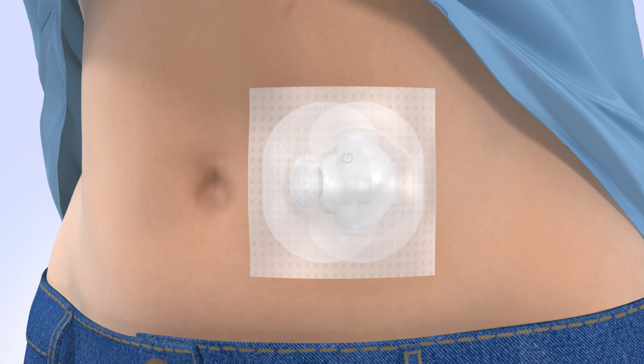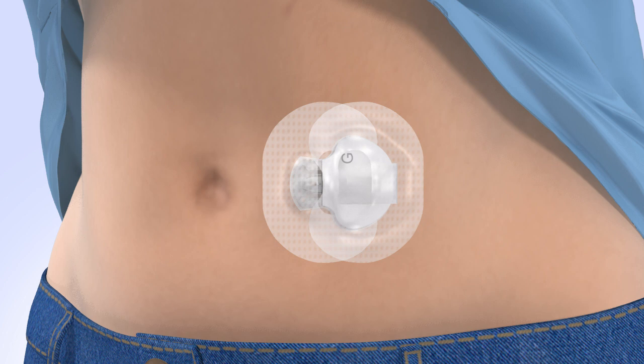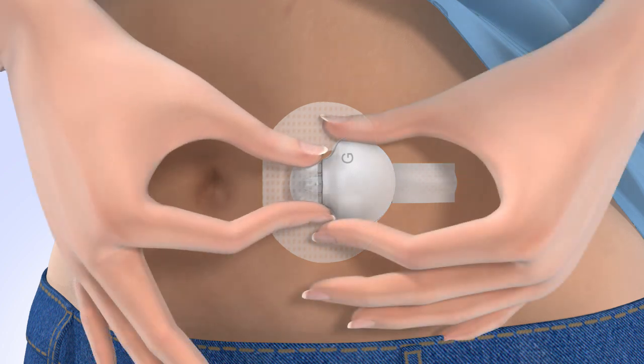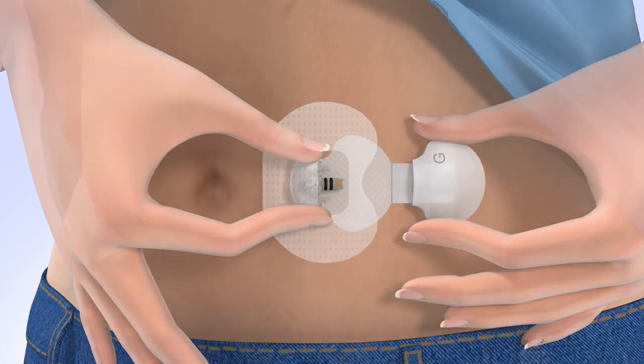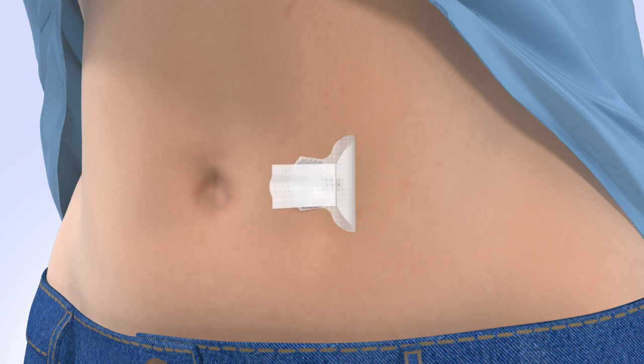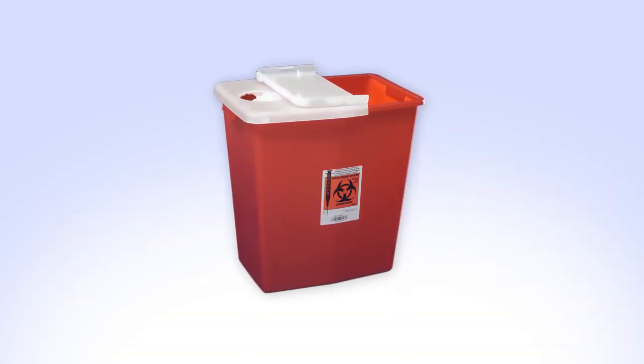First, remove any optional adhesive you may have applied over the transmitter and sensor. Next, remove the oval tape that is covering the transmitter. Peel the adhesive tab off the transmitter. Disconnect the transmitter by pinching the flexible arms of the sensor with one hand and pulling the transmitter away with the other. Now, peel off the oval tape that is covering the sensor. Loosen the sensor adhesive by lifting up the adhesive tab. Remove the sensor from your body. Discard the sensor in a sharps container.